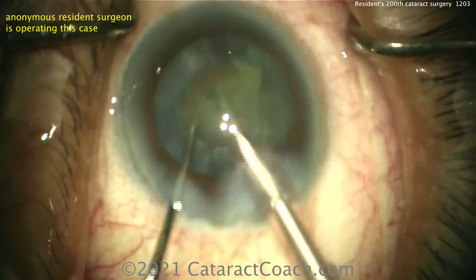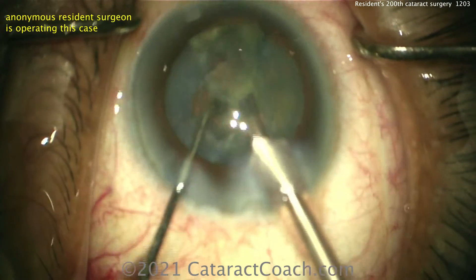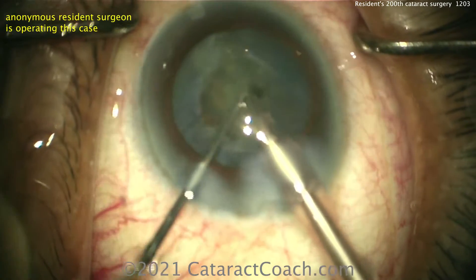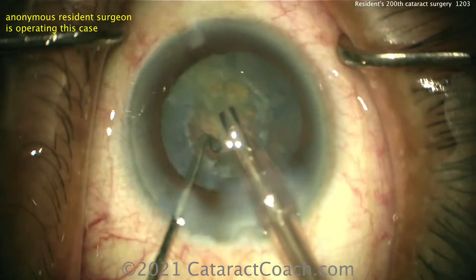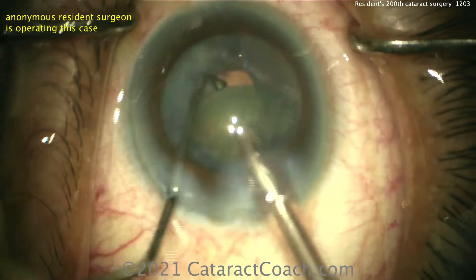So we're 200 cases in and you are doing very well. Keep up the good work. Just remember, you can't be a great surgeon if you haven't done a thousand cataracts — so keep up the work. But I have great hope for you; I see a lot of promise here in the skill set.